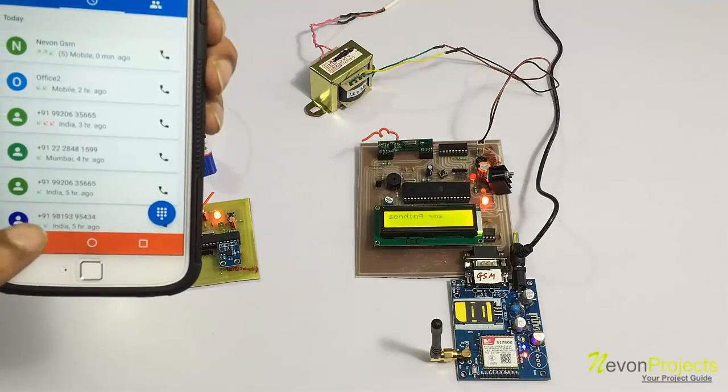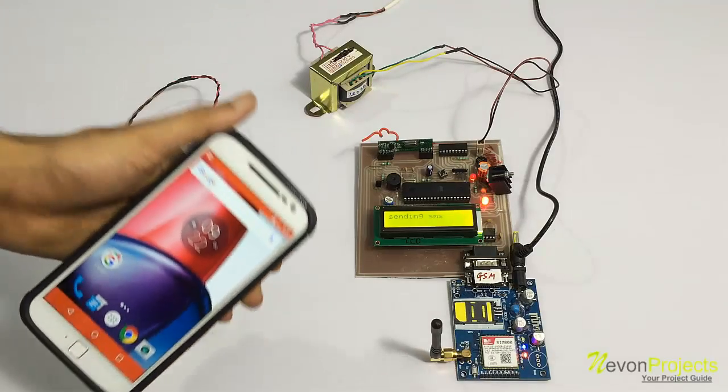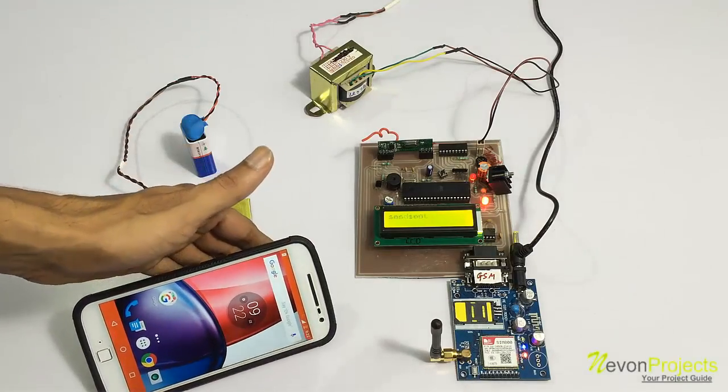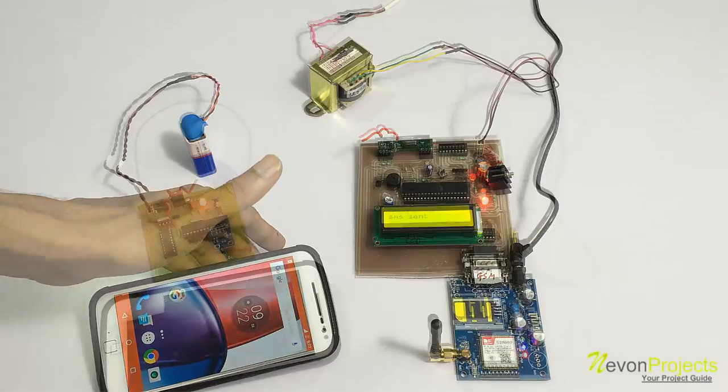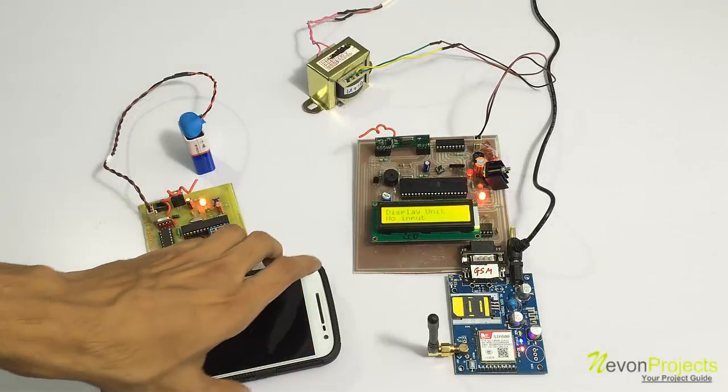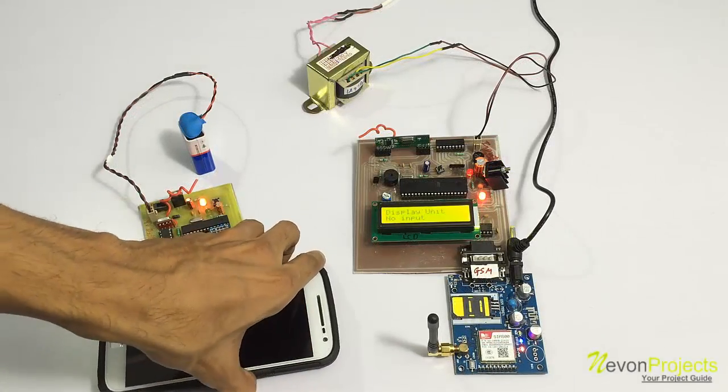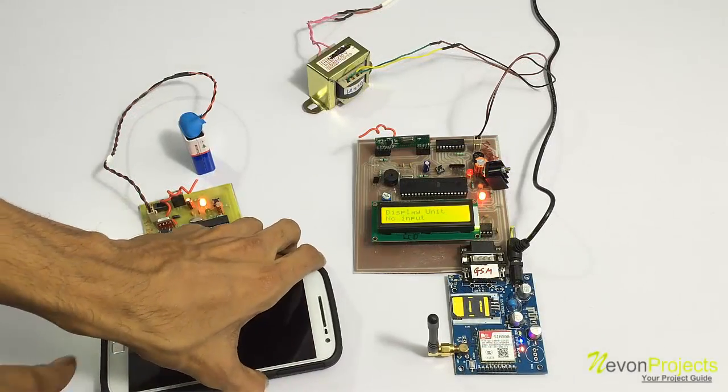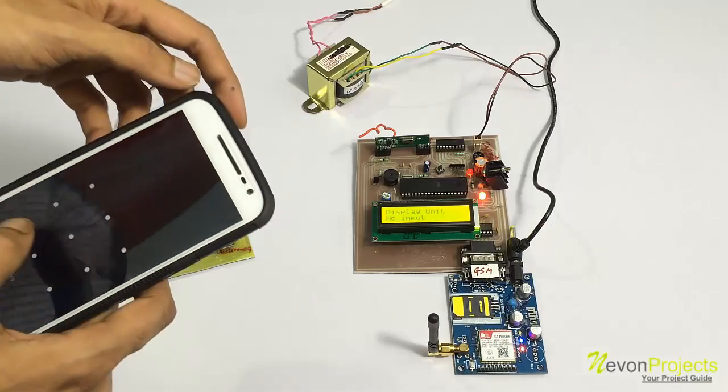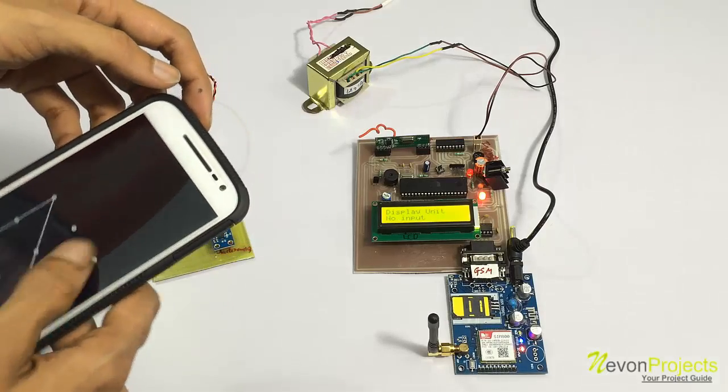As you can see, we have registered the number here. We also receive the message that our number has been configured into the system.